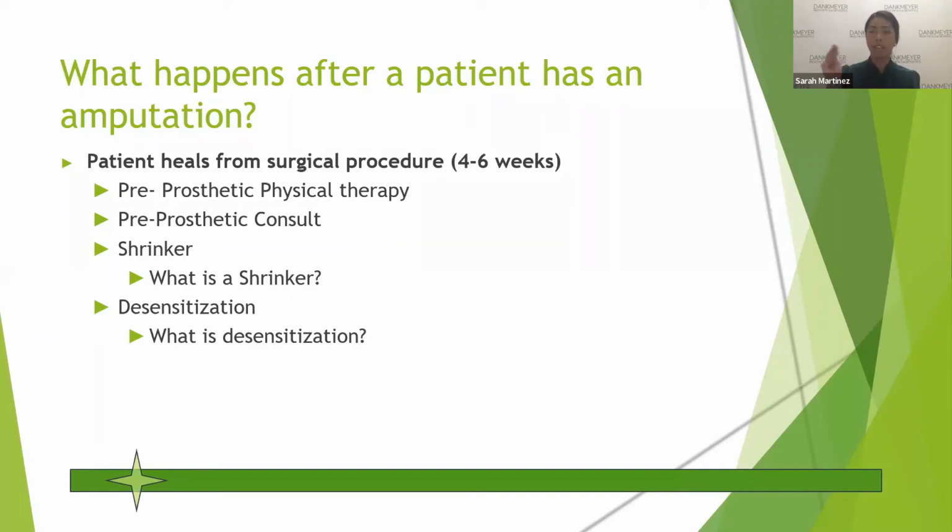a running leg. One thing that we did do was, it was a brand new amputee, and for example, she was in a total knee in the beginning, and the game plan that we had set forth was, let's get you into physical therapy. Let's prove that, one, you're wearing your prosthesis, you're able to use it, it's functioning appropriately for you, and you're tolerating it. So you're building this case.